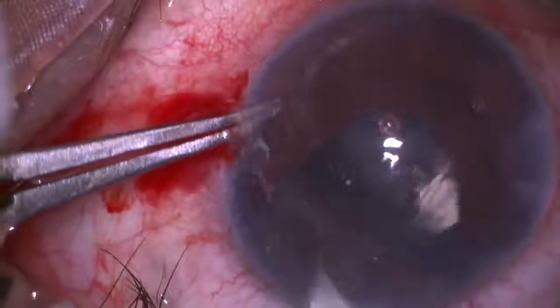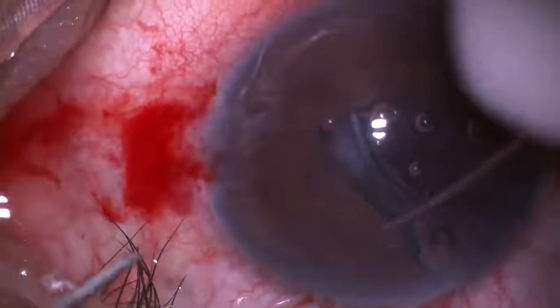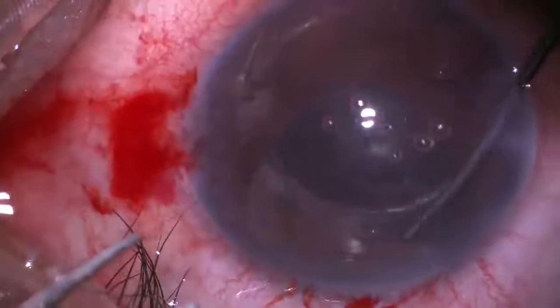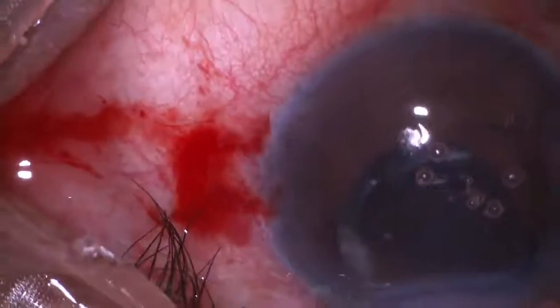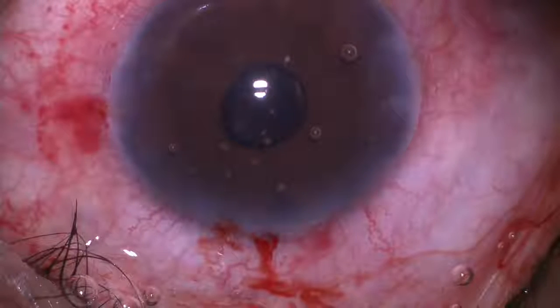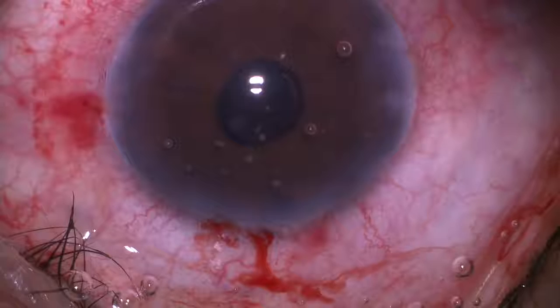A 6 mm clear corneal tunnel was made. IOL was explanted in toto. Pupil was constricted by injecting intracameral pilocarpine. Peripheral button iridectomy was performed.